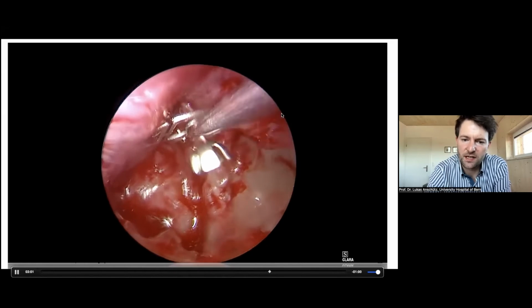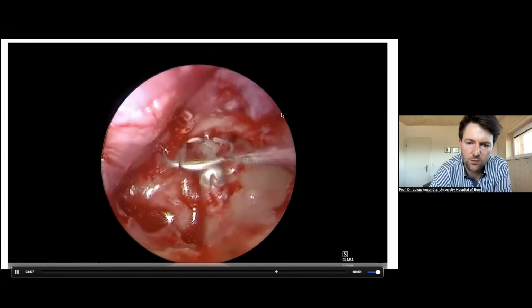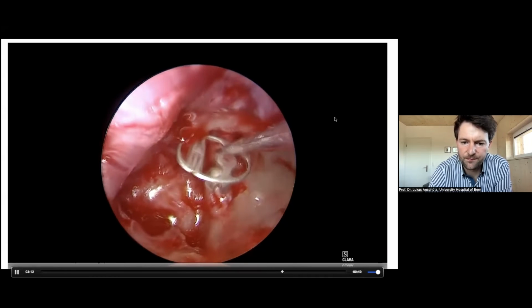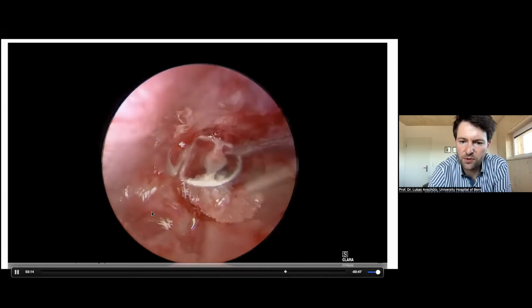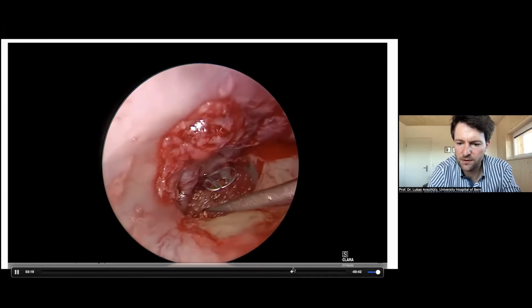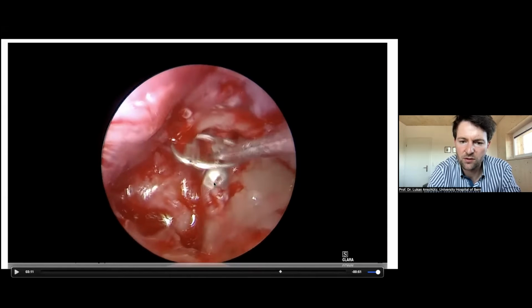And that's why I decided I can leave this case in an exclusive transcanal way, and we can put here now another prosthesis, also a partial prosthesis, and perhaps I can quickly stop and come back. So you can see now it's not a clip here, it's like a bell-shaped connector, and it fits very well on the stapes, and you are actually quite mobile on how you want to position it.